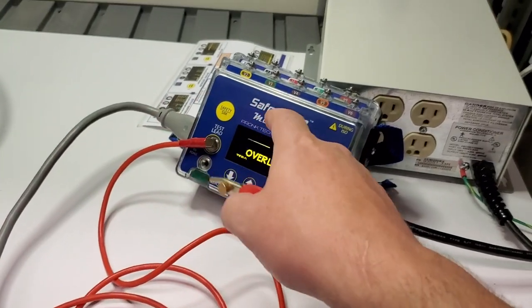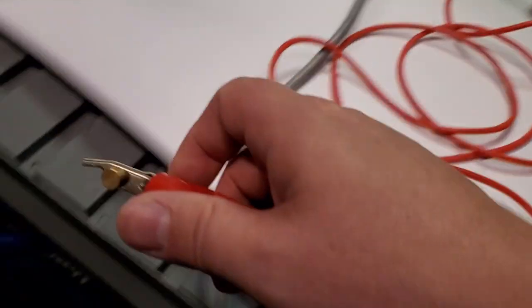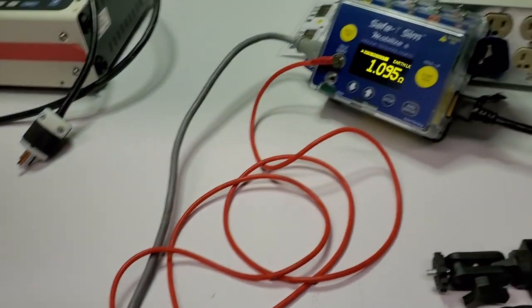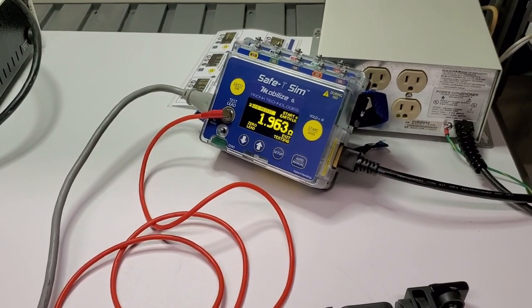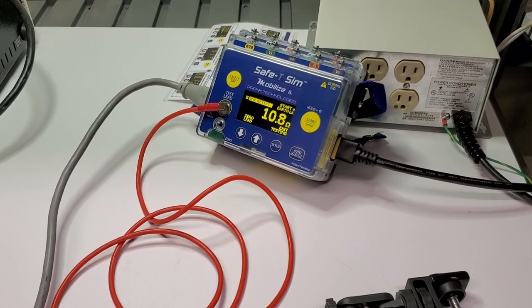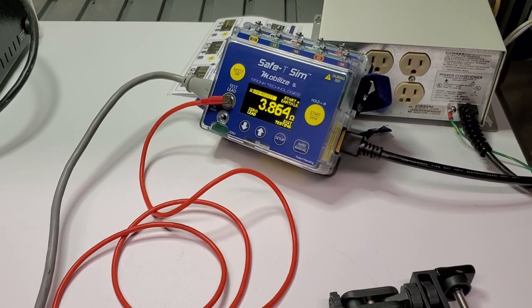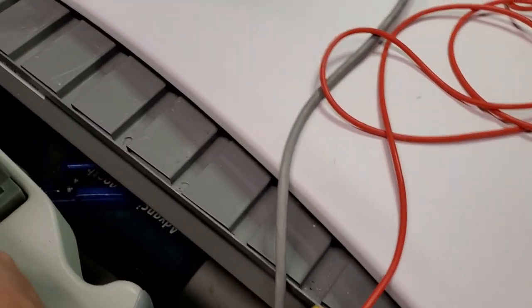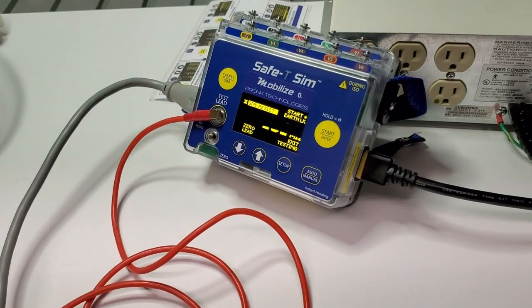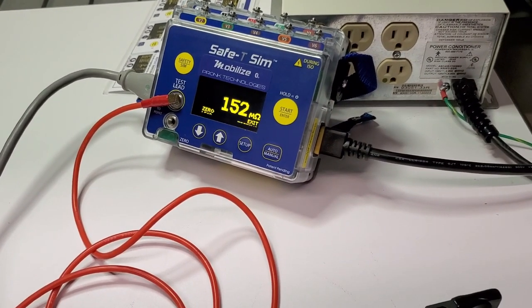Even in manual mode, you can see it shows you when it does not have a good ground. I'm going to fish around here — you can see it's searching, and it's going to start alarming. Once I get it onto an even better ground, it stops flashing and it's good to go.